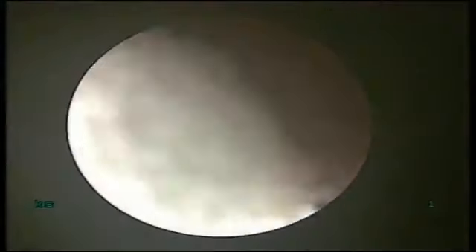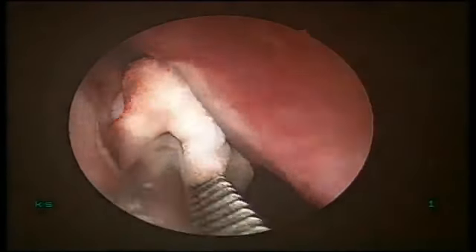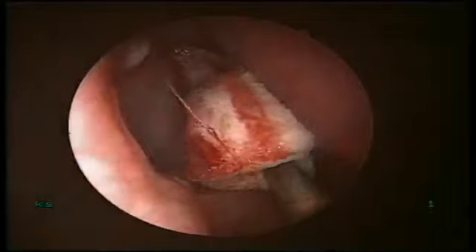So let's decongest the area completely. Clean the area with the Merocel. See that once you mop with the Merocel, the bleeding will go away like magic.